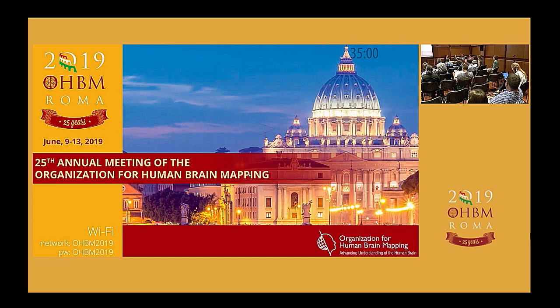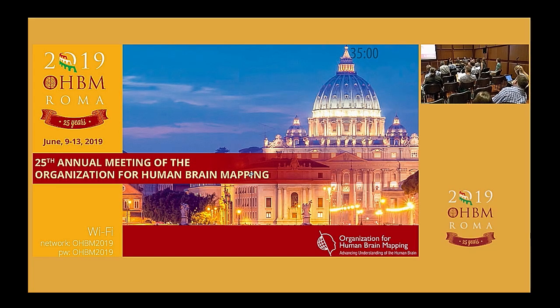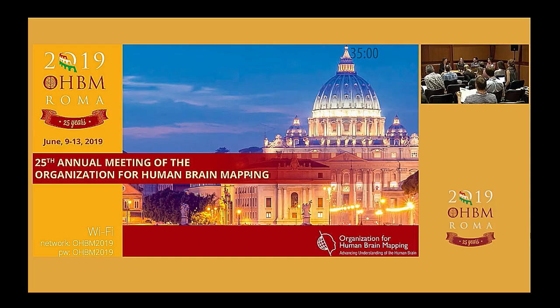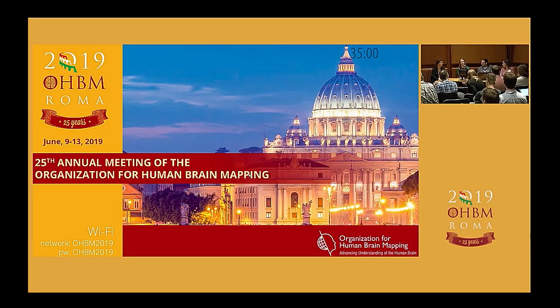Well, I think he was actually asking the physicist, but I can say, yeah, so at our centre, we don't do checklists for when people are scanning per se, apart from all of the safety aspects, and that is very heavily checklisted to have the proper processes in place. However, you're not allowed to scan unless you've already been a secondary scanner for another study. So that helps us too. First of all, there's the theoretical education of how to actually operate the scanner, how to behave in that environment, and how to check for data quality.